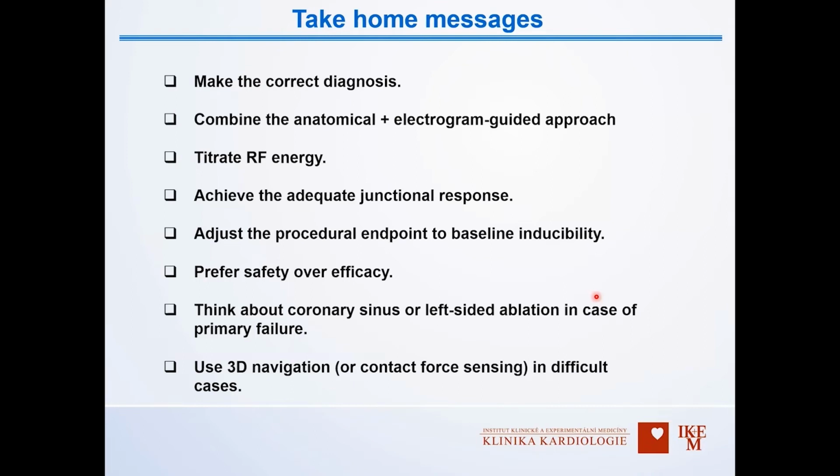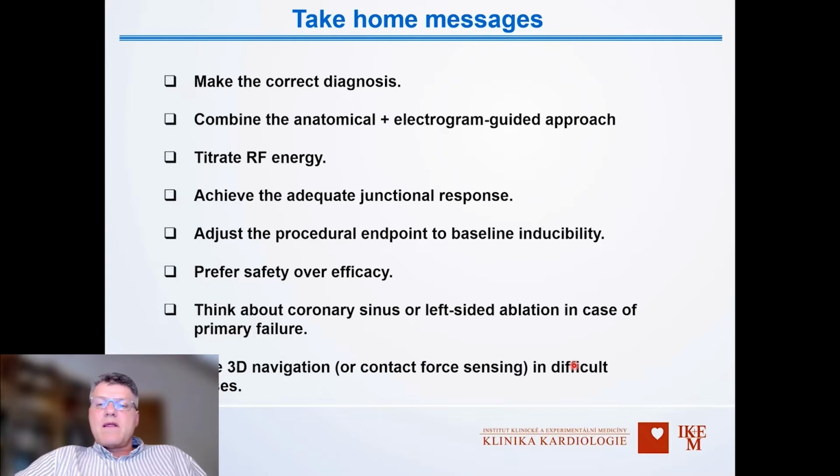My take-home messages are as follows. Make the correct diagnosis. Combine the anatomical and electrogram-guided approach. Titrate RF energy. Achieve the adequate junctional response. Adjust the procedural endpoint to baseline inducibility. Prefer safety over efficacy. Think about coronary sinus or left-sided ablation in case of primary failure. And use 3D navigation or contact force sensing in difficult cases.